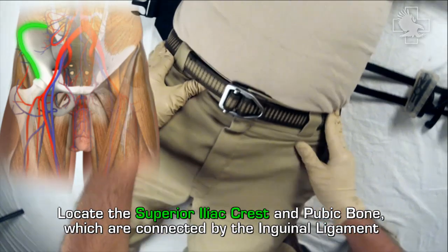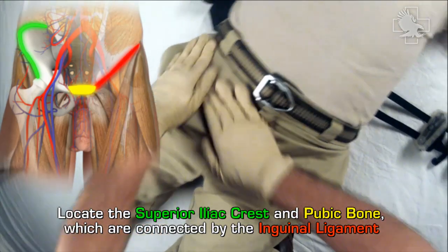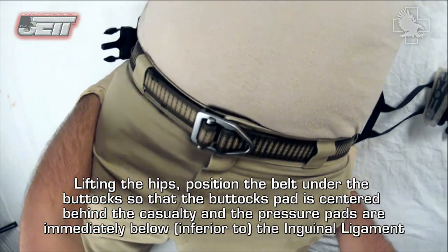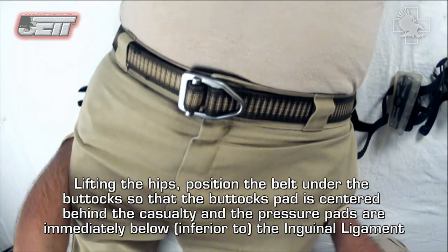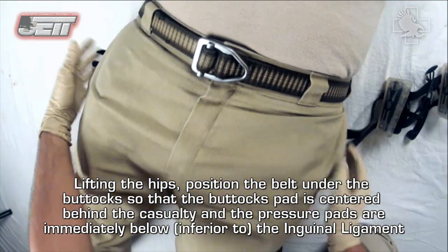Locate the superior iliac crest and pubic bone, which are connected by the inguinal ligament. Lifting the hips, position the belt under the buttocks so that the buttocks pad is centered behind the casualty and the pressure pads are immediately below — inferior to — the inguinal ligament.